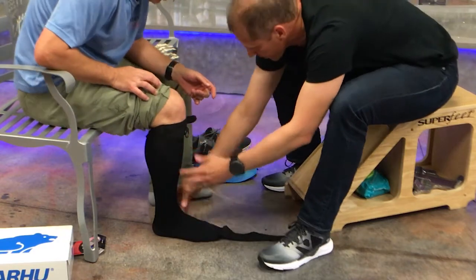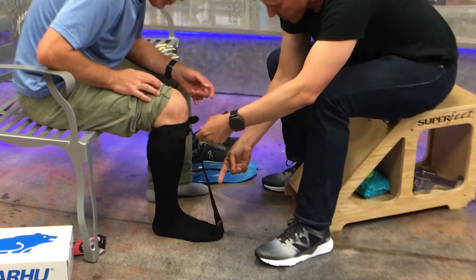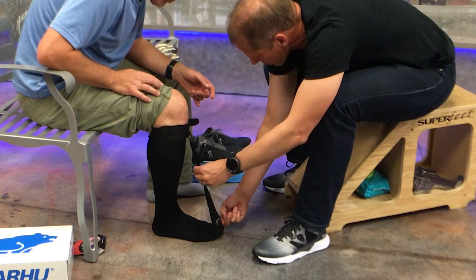Put your foot flat on the floor with your ankle at 90 degrees. Then we're going to undo this toe strap. Now I want you to relax your toes. I'm going to pull your toes up just about a half inch or a finger width off the floor and refasten this strap.